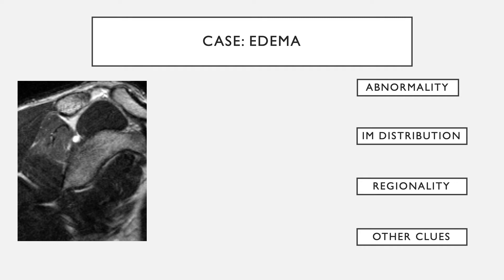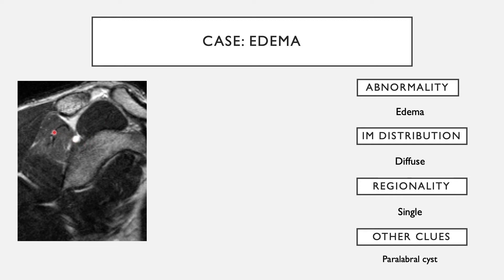In this shoulder case, the primary abnormality is edema. The infraspinatus muscle is clearly more hyperintense than the remaining muscles — supraspinatus, teres minor, and subscapularis. There is also a small paralabral cyst sitting in the spinoglenoid notch. The suprascapular nerve traverses through the spinoglenoid notch after giving a branch to the supraspinatus nerve. Therefore, compression by this cyst affects only the infraspinatus innervation, producing denervation-related edematous changes within that infraspinatus muscle.